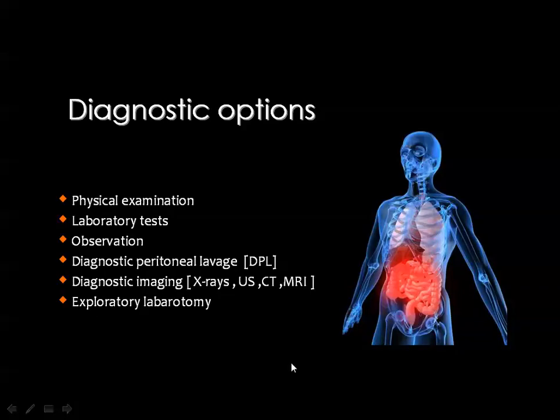But what is commonly seen in clinical practice is patients with blunt abdominal trauma, where the availability of multi-detector CT has greatly facilitated imaging and the diagnosis of these cases. Then these are the diagnostic options, including the physical examination and some laboratory tests, and many of the patients with no emergency imaging or minor blunt trauma may be put under observation.